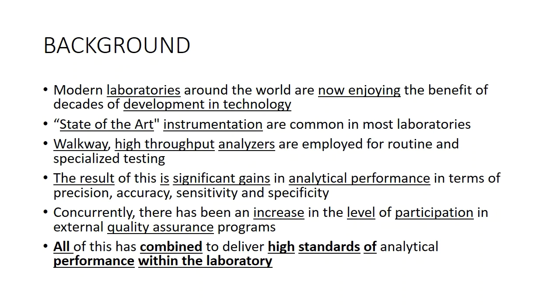But what is the problem in the pre-analytical area? To err is human, because it is much more human dependent till now. In countries abroad, they have now introduced cobots, robots, which help the phlebotomist in collection of blood. There has been total lab automation, with pneumatic chutes also. There are many instruments used for sample transportation from one department to another. There has also been some use of artificial intelligence. So in outside countries, they are trying to control pre-analytical error in a more robust way with the help of automation. But in India and all developing countries, the scenario is far behind, and improvement has also not been up to the mark.